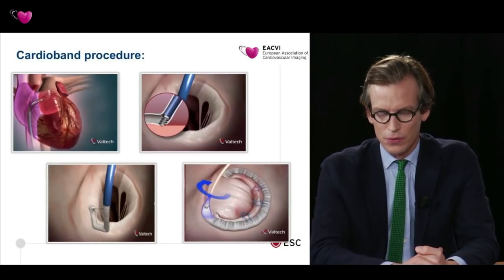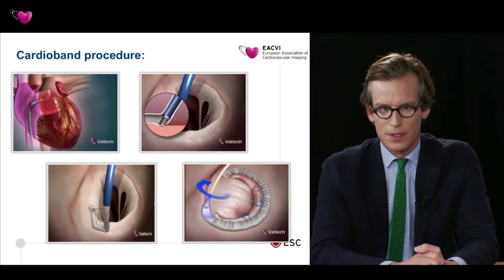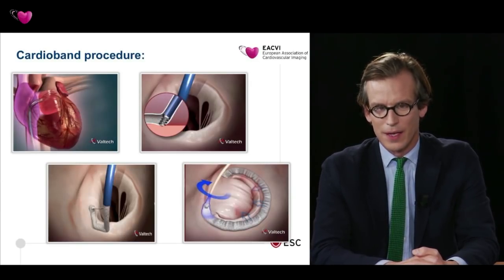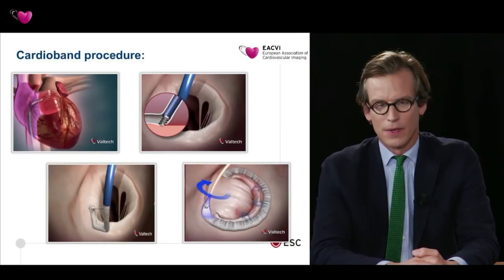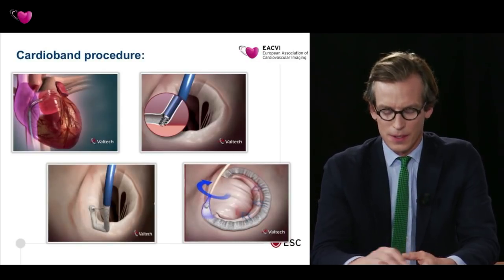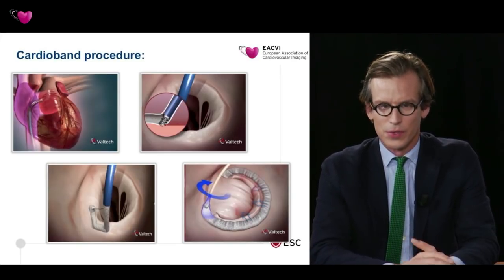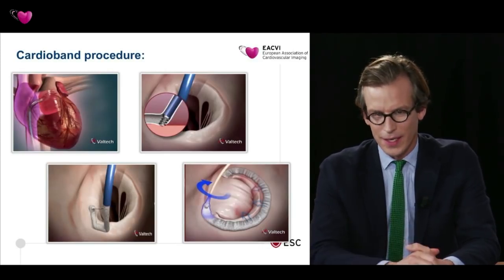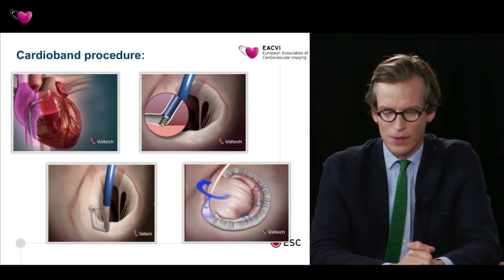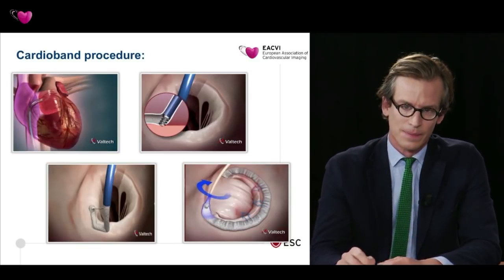And for those who did not think directly about this CE-marked device, I'm showing you how this works. It's the Cardioband device that anchors a tissue band around the posterior part of the mitral annulus, which is then cinched by a wire that runs inside, which is shortened. As you can figure out easily, this is a complex procedure. It is heavily based on multimodality imaging. And the question again is, can't we take information into the hybrid OR and fuse it that beforehand was separate?